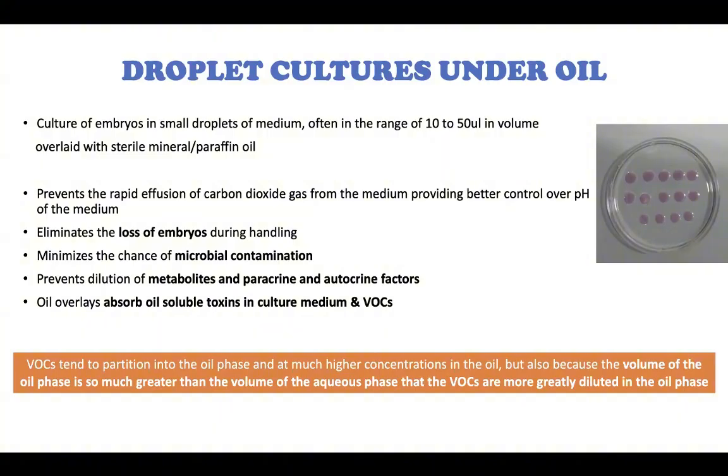VOCs also tend to partition in the oil phase at much higher concentration in the oil, but also because the volume of the oil phase is so much greater than the volume of the aqueous phase, the VOCs are diluted. So the VOCs get diluted or are trapped in the oil phase and they are not able to reach the liquid phase.